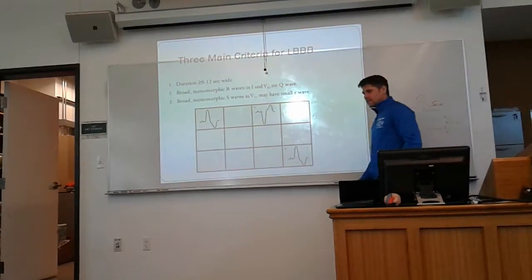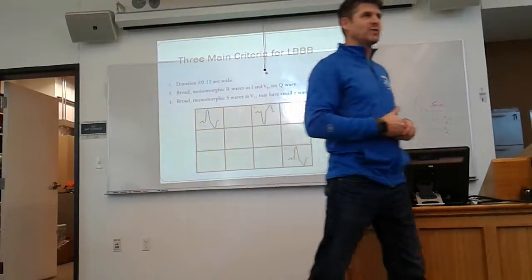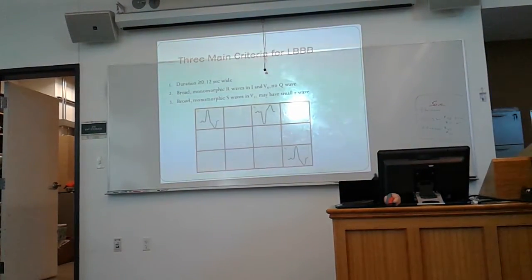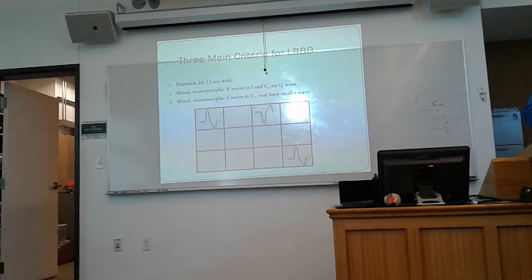I know that we often look in lead 2, and everybody likes lead 2, but they like lead 2 because that's what they were exposed to first, right? You guys were all exposed to lead 2 first. But lead 2 isn't always the best lead for you to look in. You need to be open-minded and judicious about what lead you might be looking at.